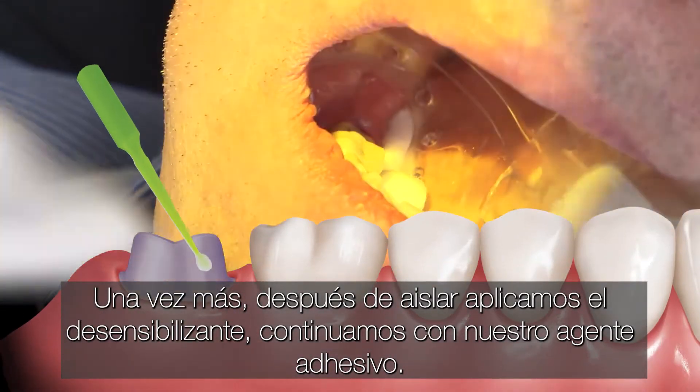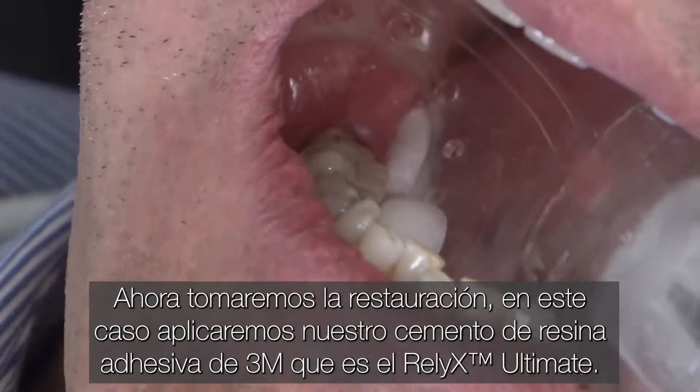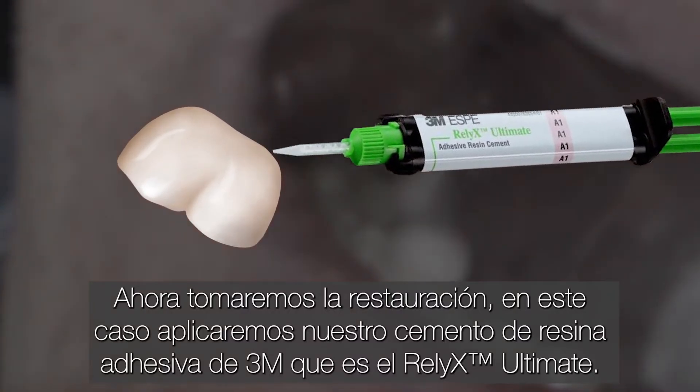Again, after isolating, we applied the desensitizer. We followed up with our bonding agent. Now we'll get the restoration. We'll apply, in this case, our adhesive resin cement from 3M, which is the Relyx Ultimate.